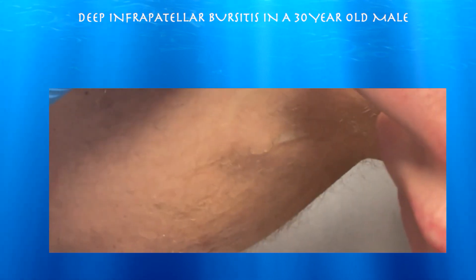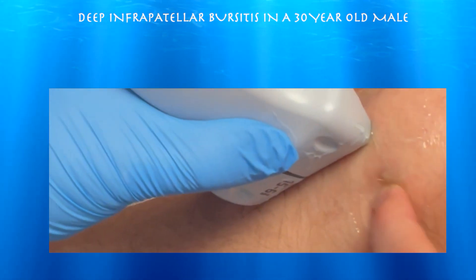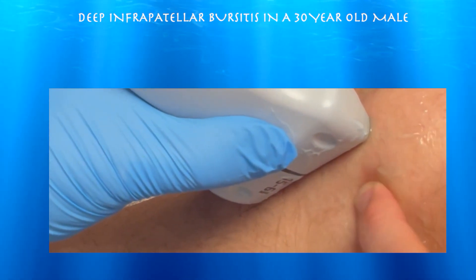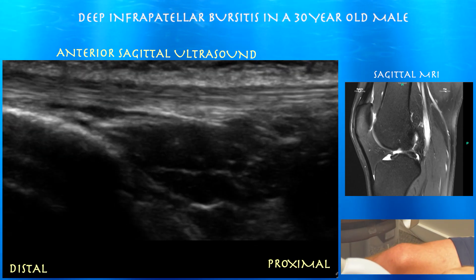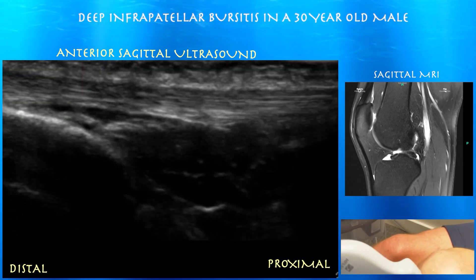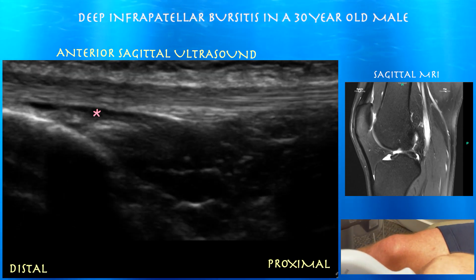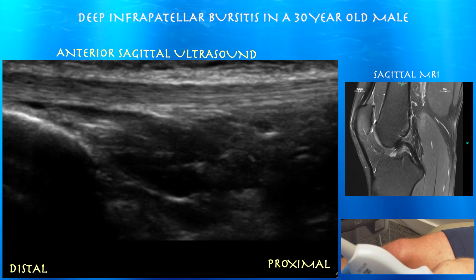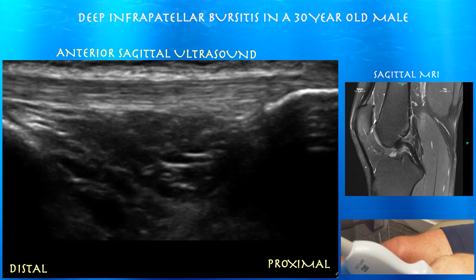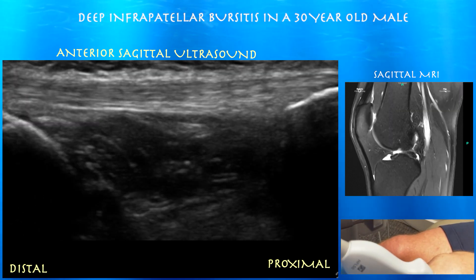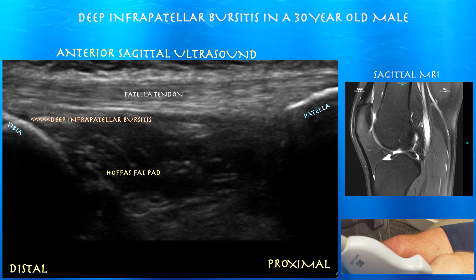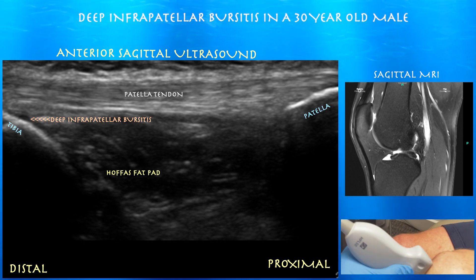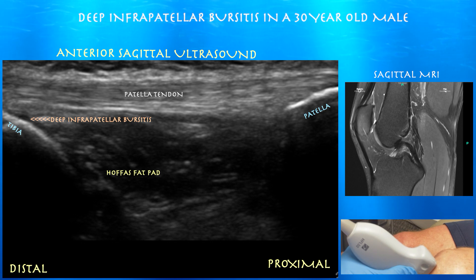That bursa does go up. The pain is usually right where my finger is. Here we are at 11:05 — again we can see some fluid underneath the distal patella tendon. Distal is to the left of the screen where you can see the tibia. We're not seeing any fluid in the proximal aspect of Hoffa's fat pad. The actual patella tendon itself looks fairly normal.